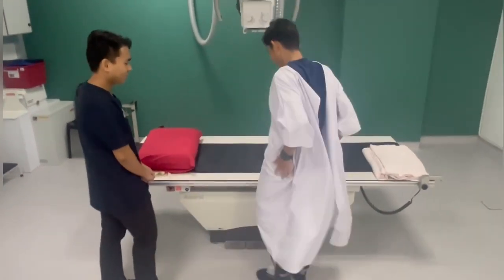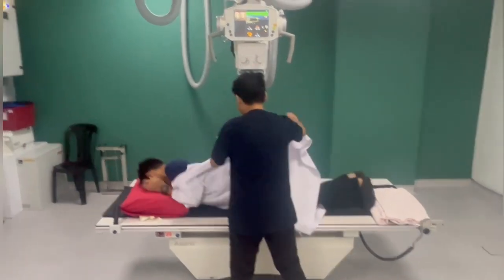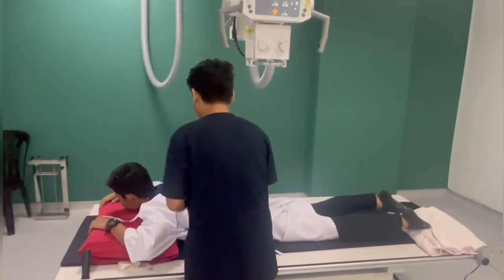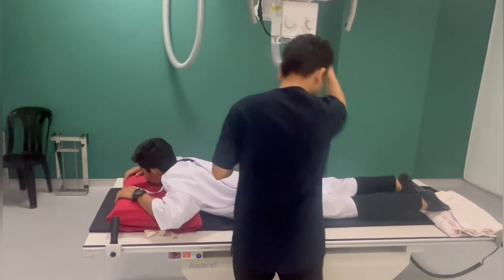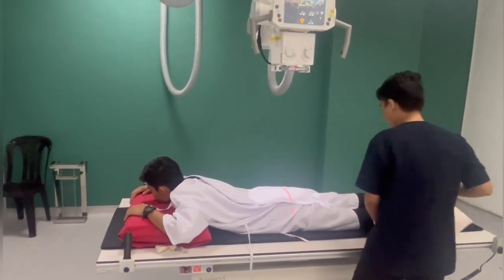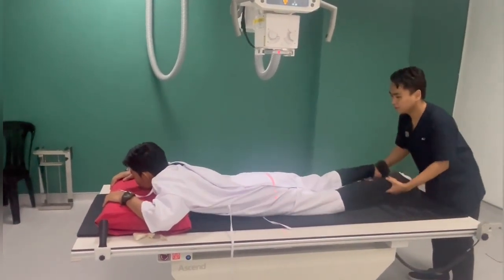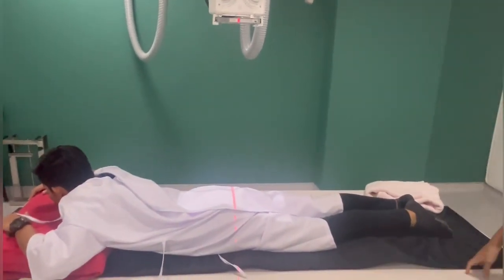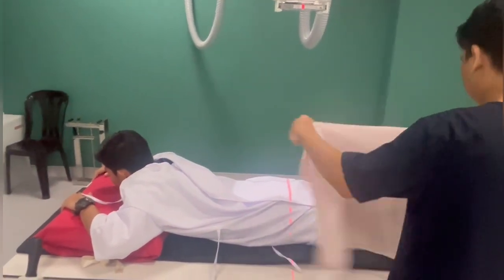Ensure the patient removes the shoes, and then we need to ensure the patient's safety so they do not fall down. So we are going to help the patient. Now the patient is in prone position, and we're going to do the PA projection of the abdomen. Align the MSP of the patient to the table to ensure the patient is not tilting. Then cover the patient with the blanket.